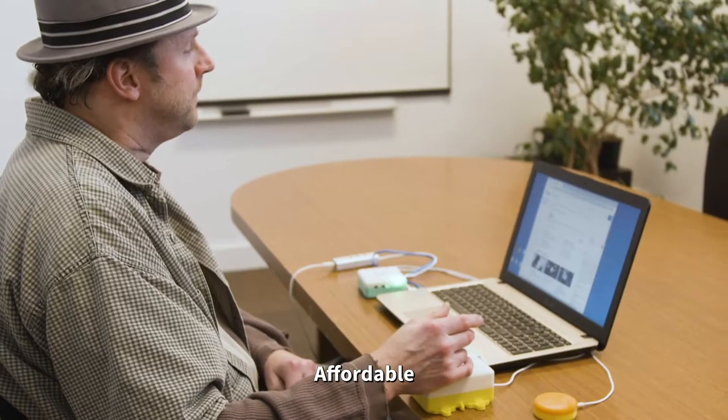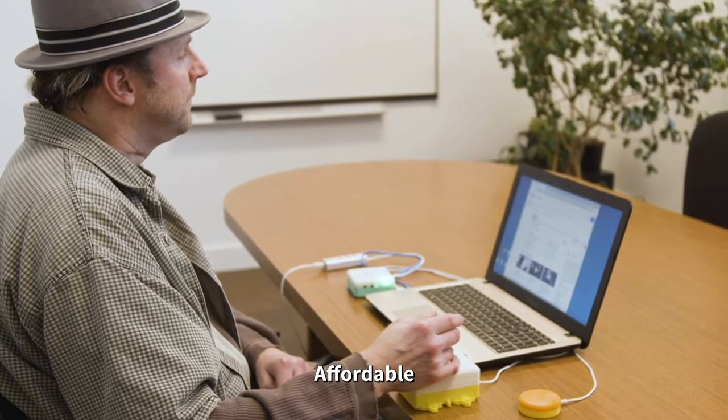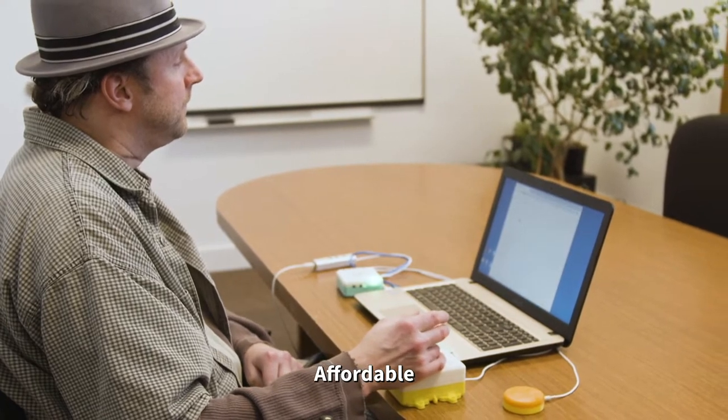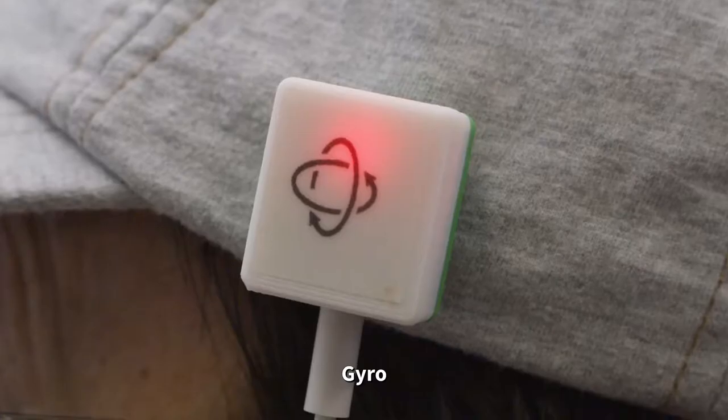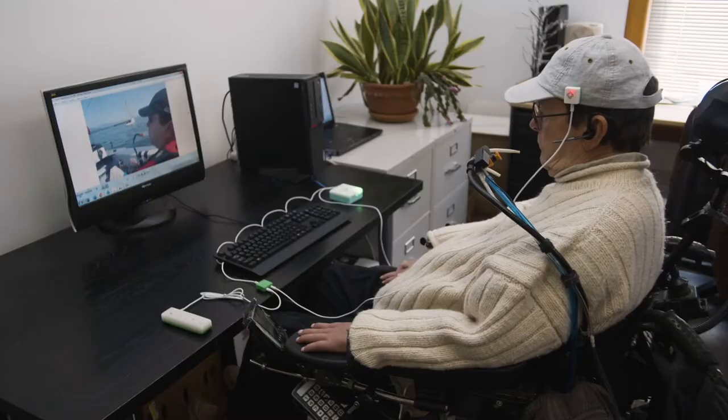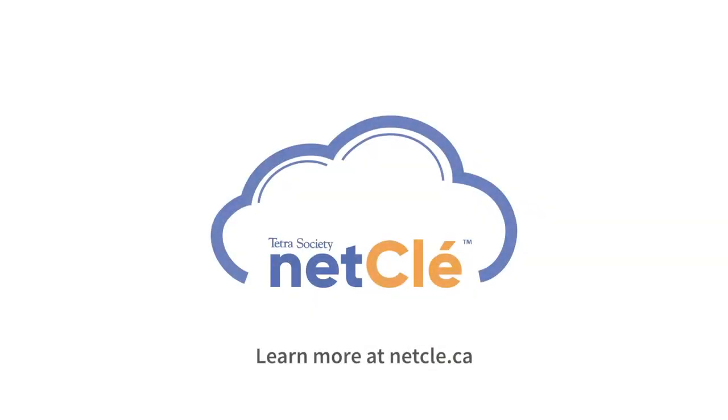By using open source software and inexpensive hardware, netClé is available at an accessible price. From a single button to joysticks and gyros, users no longer have to consider their barriers — they can consider the possibilities. Please visit us at netcle.ca to explore the possibilities and start your journey with netClé.